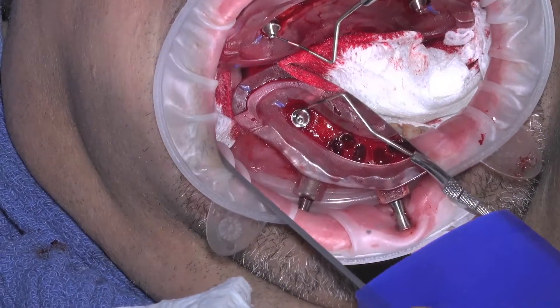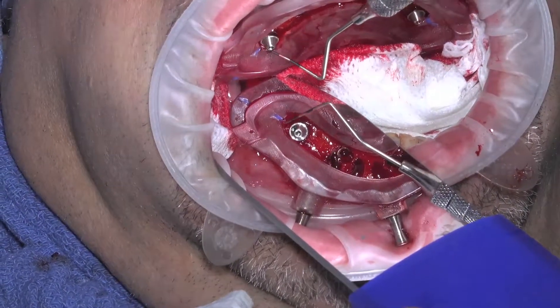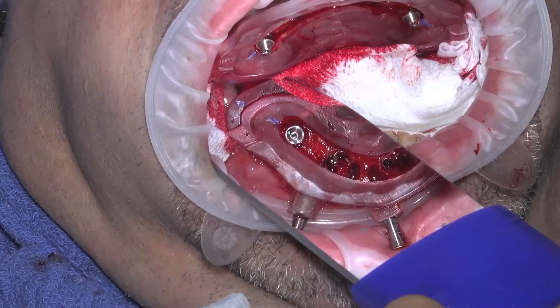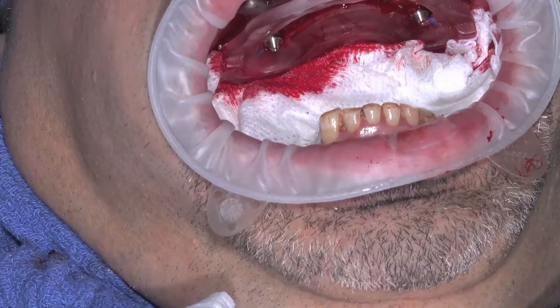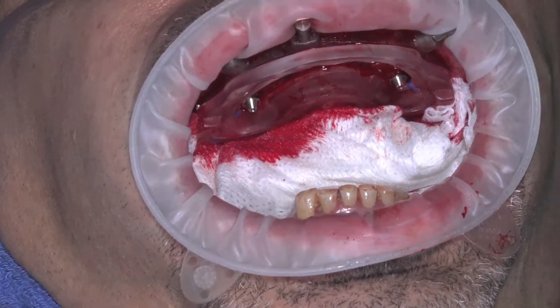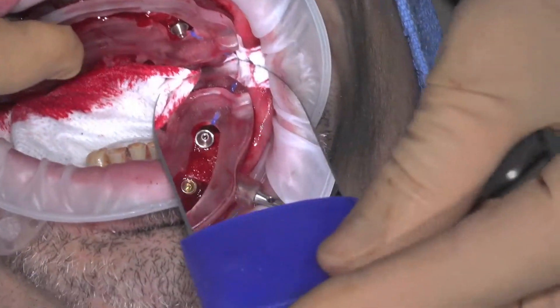Use a mirror to verify that the multi-unit abutments are in the correct position. The purpose of the angle rotation guide is to bring the blue line right up to the implant site for a better visual reference. This blue reference line is also located on the surgical guide. Refer to the photographs included in the envelope depicting the correct position.